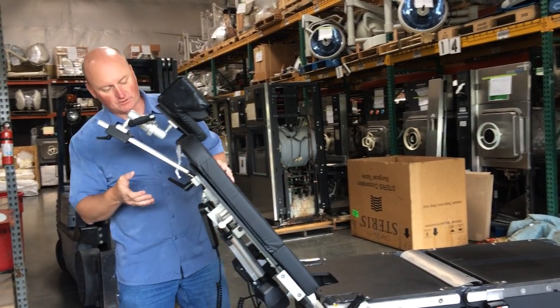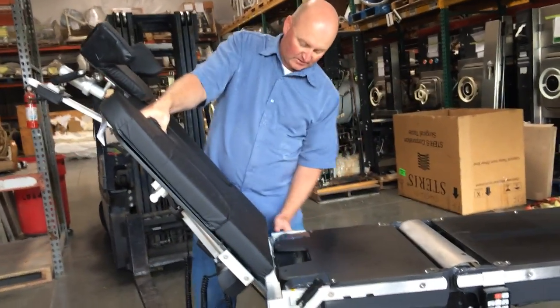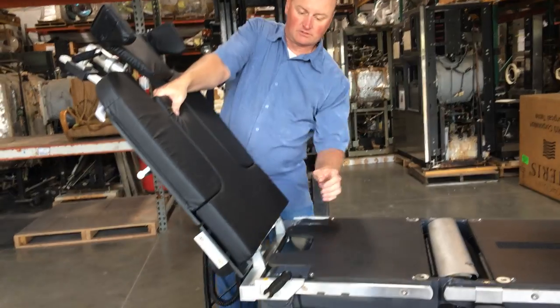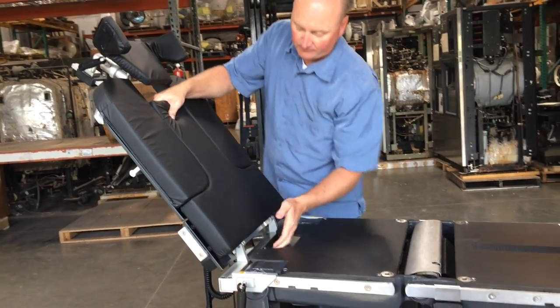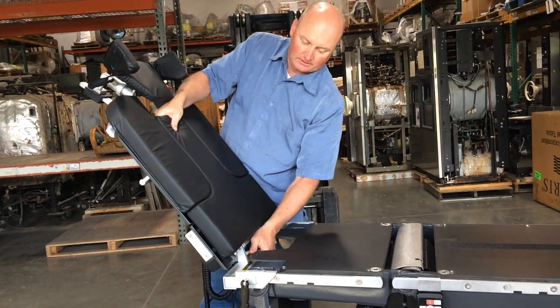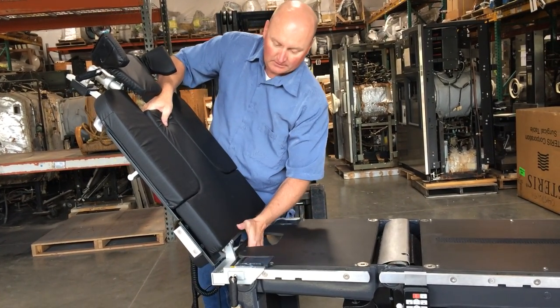As far as mounting and unmounting is concerned, you usually want to grab it right through the back of the shoulder blades here. There are two handles, one here and here — you're going to loosen those. Then grab it from the center and just get it loose all the way, and it'll slide right off.